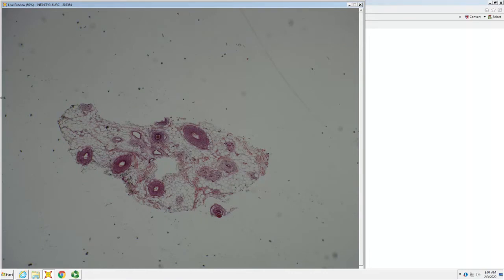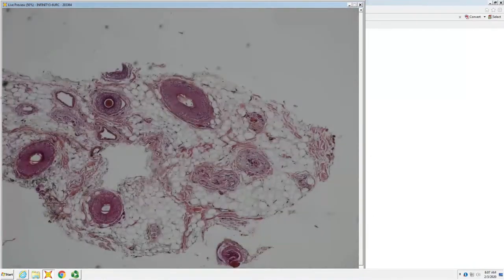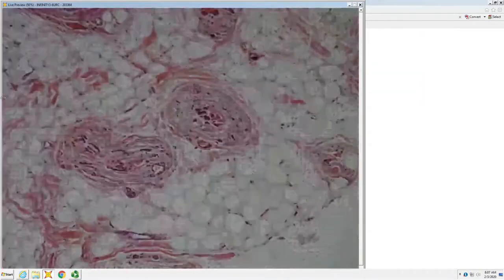Oh, man. Alopecia areata. So AA, and anytime you say AA, you also have to say syphilis. So AA, syphilis, and pattern alopecia. So just by seeing that you have different sizes of the follicles, you're down to three things: alopecia areata, syphilis, or pattern alopecia. So the next thing we're going to do is look to see in the fibrous tracts, is there pigment?